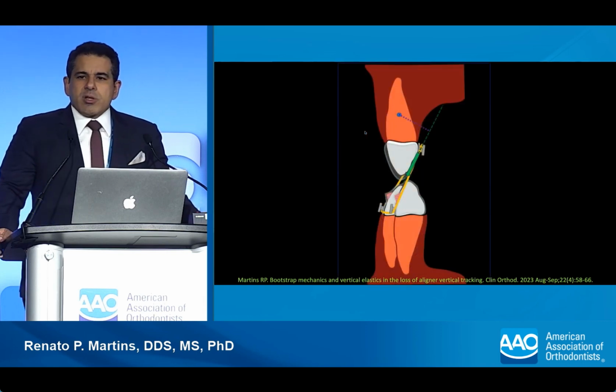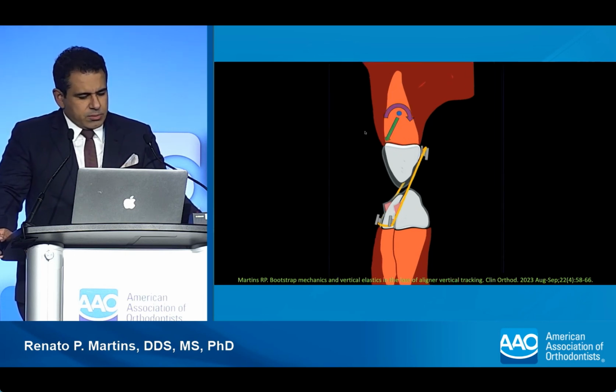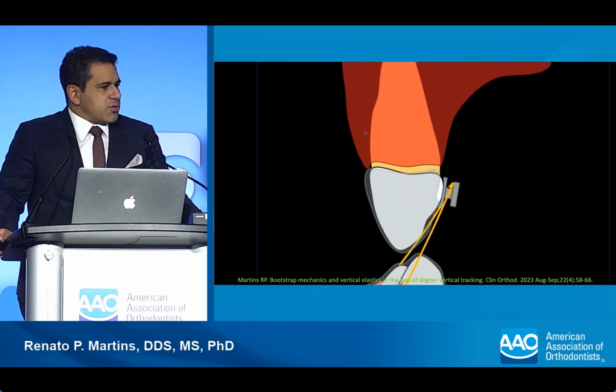Even when you're using inter-arch elastics, the same thing will apply. So I suggest that we always use a force coming from the lingual to the buccal. And that's going to bring the tooth that you want to extrude away from collisions.